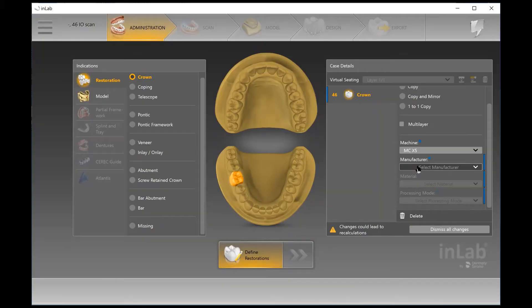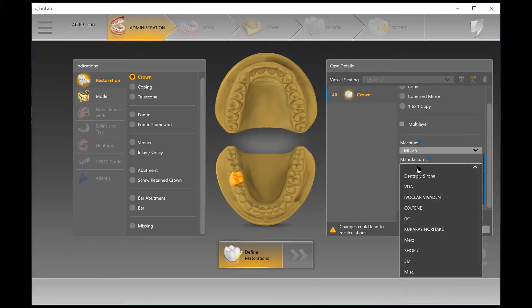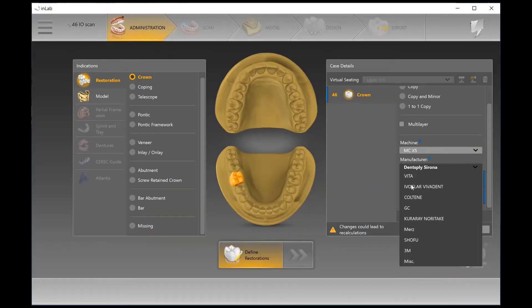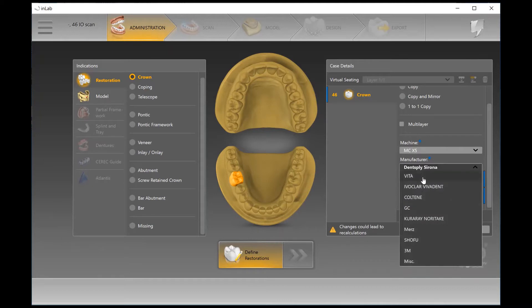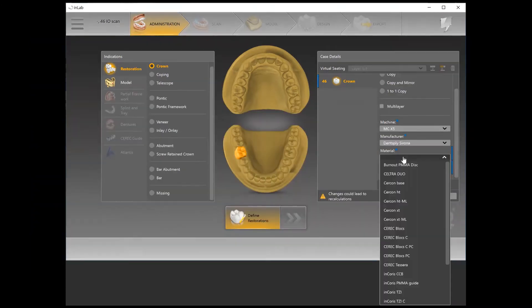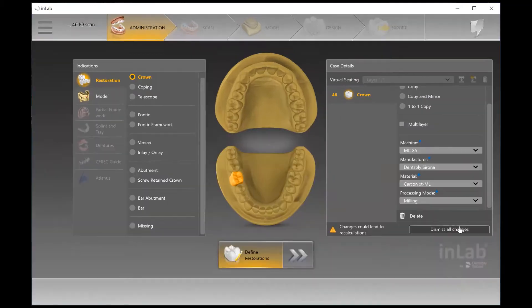From here you want to identify the machine — whether you add a generic device for third-party machines or if you are using a Dentsply Sirona MCX5 or MCXL, you can identify it as such. Then we can identify the material of our choosing. Here I'm going to select Dentsply Sirona and Cercon XTML, which is a beautiful zirconia material.